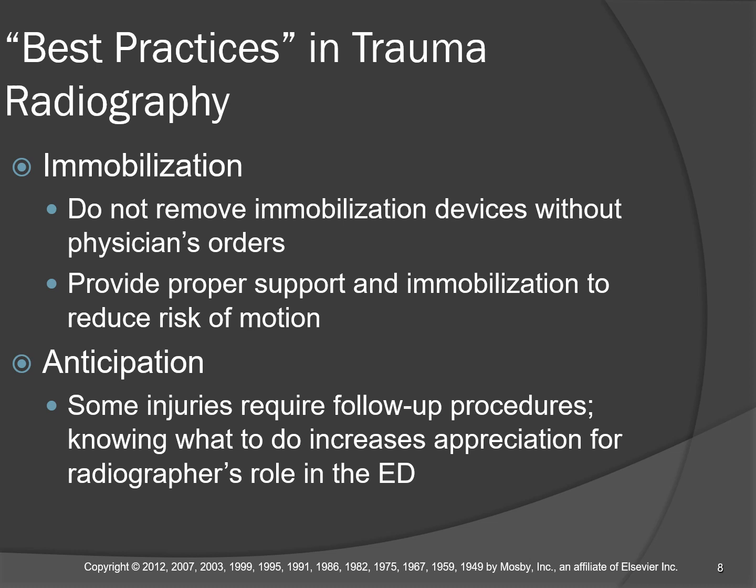Okay, he's going to make a small incision between the 7th and 8th ribs, probably, and push that hose through and run that up into the pleural space. Okay, then he's going to apply suction. Hopefully, he's thinking clearly, and before he applies suction, he will ask you for another radiograph. Make sure you get a new order, because he is making a change. So make sure you get a new order, but don't leave the room.